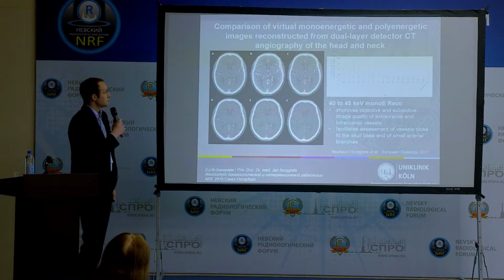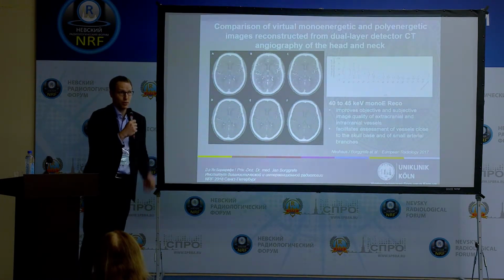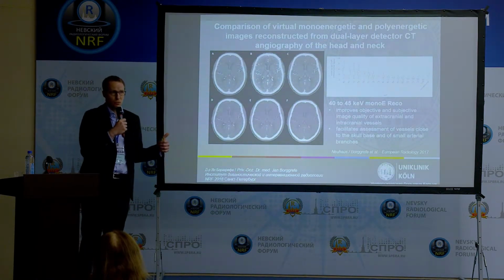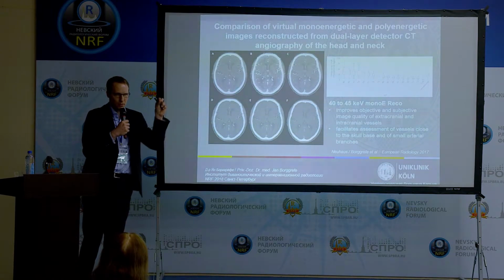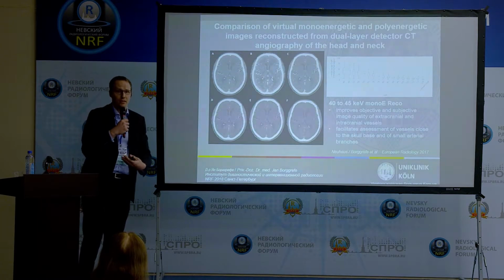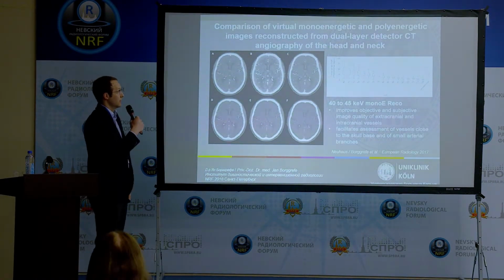What does that help? For example, if we look at the data of a CT angiography, we see a sheer boost of contrast, which can be used now in several ways. Either to depict smaller vessels that we could not see before and give them a good contrast. Then we can enhance images that are of suboptimal contrast. We don't have to target the exact correct time of the images, but also for a patient, for example, who is in cardiac failure, we might still get optimal contrast images where we could not get these with conventional imaging.